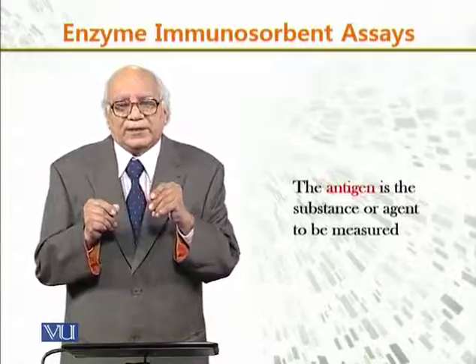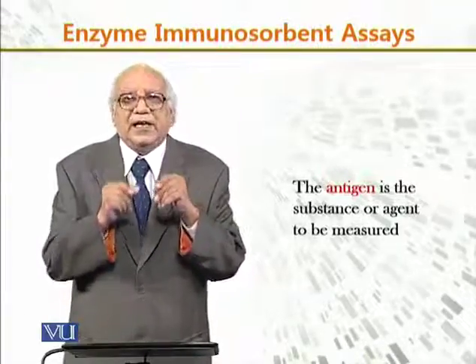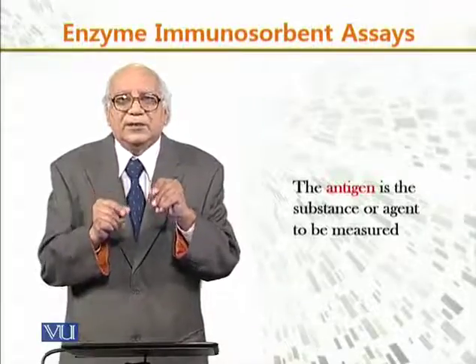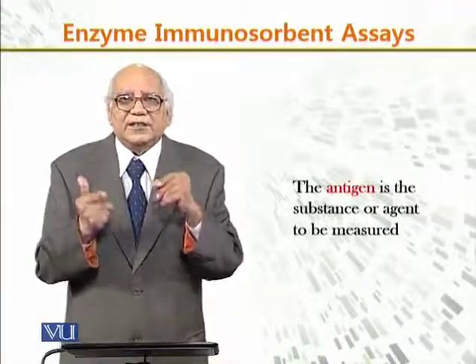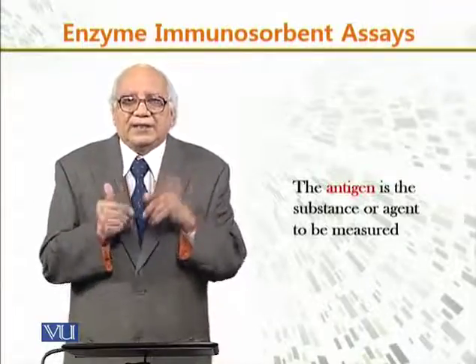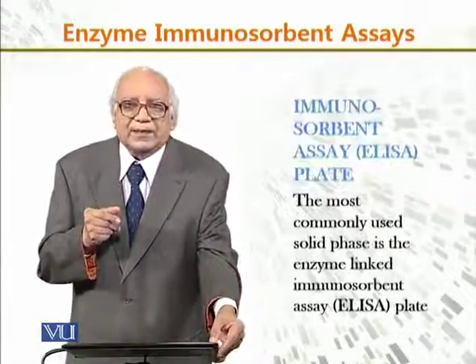So in this method, we measure the concentration of antigen due to the infectious agents, that is, the viruses or other disease-causing elements.